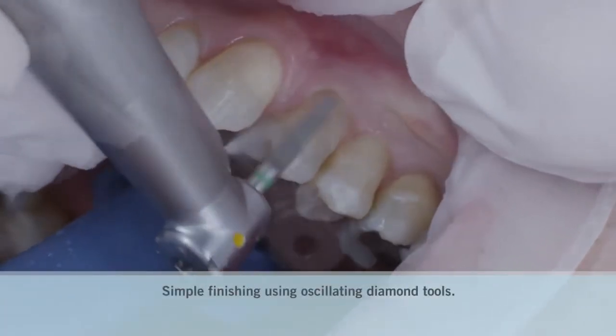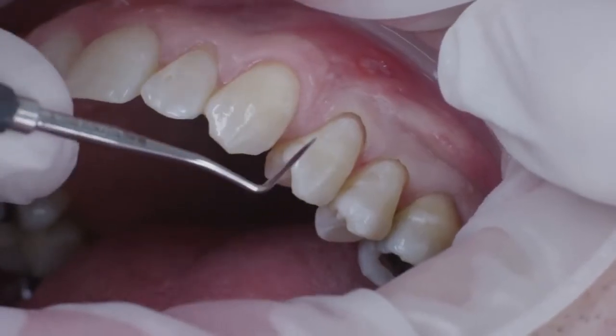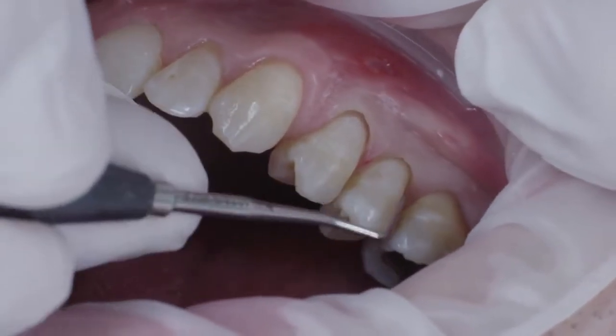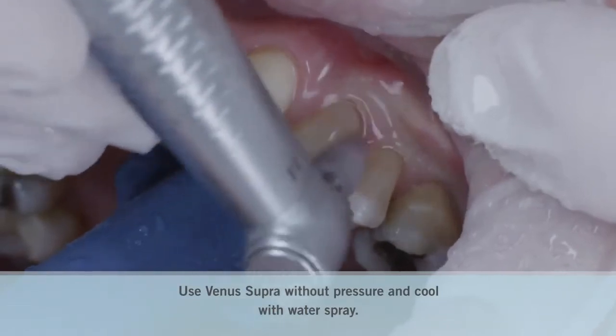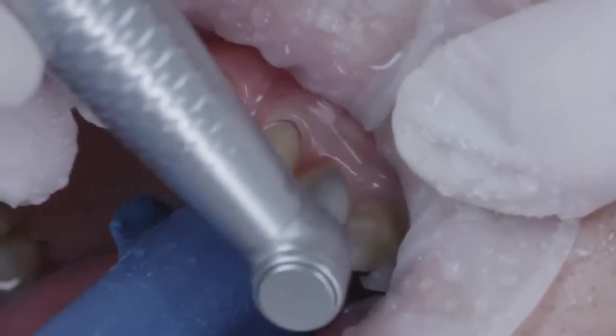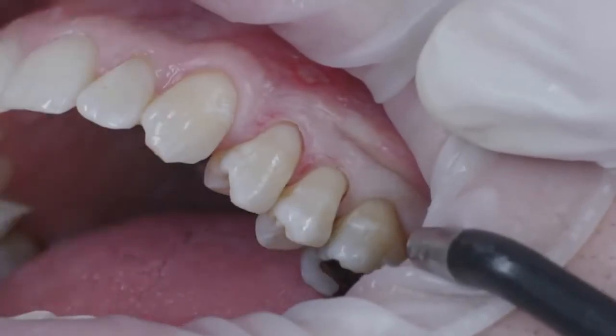I used an oscillating diamond instrument for finishing. The probe was used to verify the filling areas. Pre-polishing was then performed with the pink Venus Supra pre-polishers, using low pressure and water spray. The gray high gloss polisher from the same system was then used to polish the filling to a high gloss. I removed the cords and verified the filling in terms of aesthetic integration.